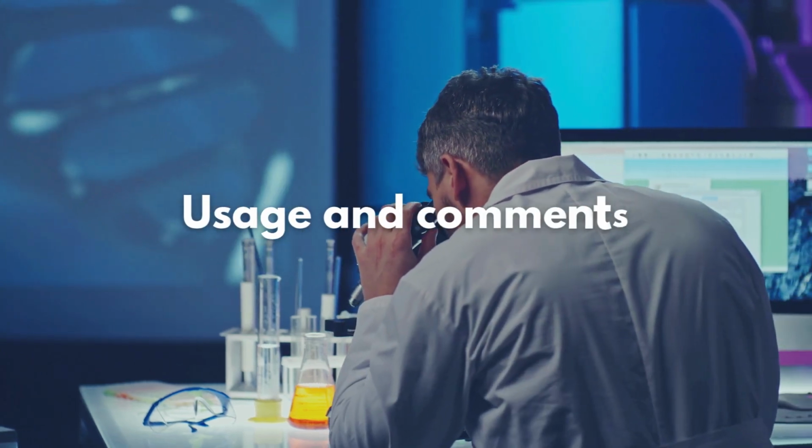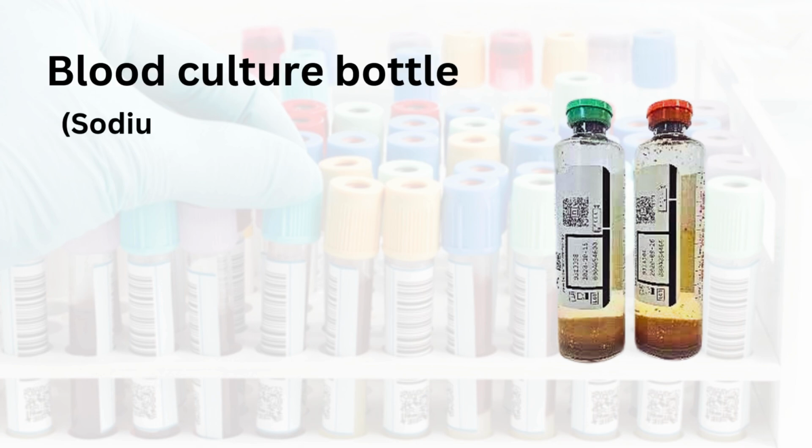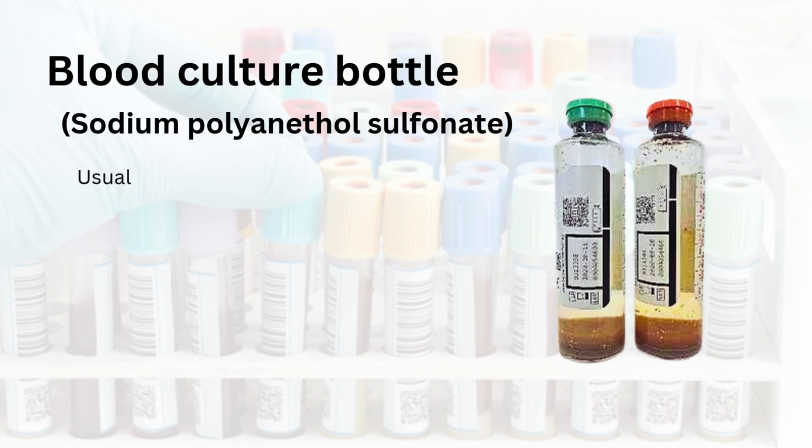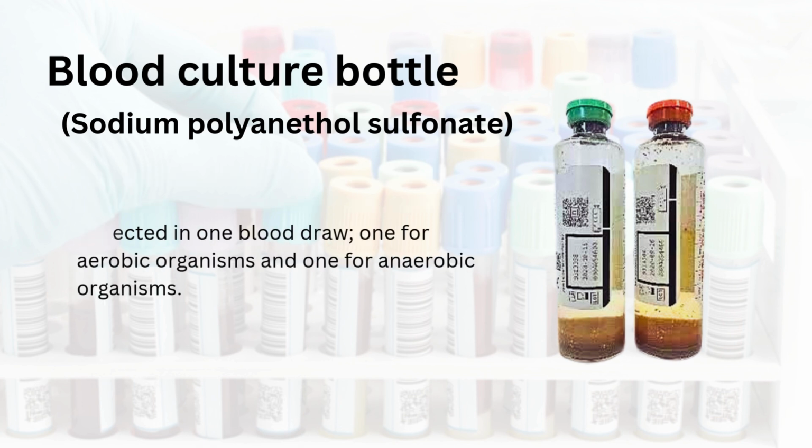Now we're going to talk about its uses and comments. Blood culture bottle, sodium polyanethol sulfonate. Usually drawn first for minimal risk of contamination. Two bottles are typically collected in one blood draw, one for aerobic organisms and one for anaerobic organisms.